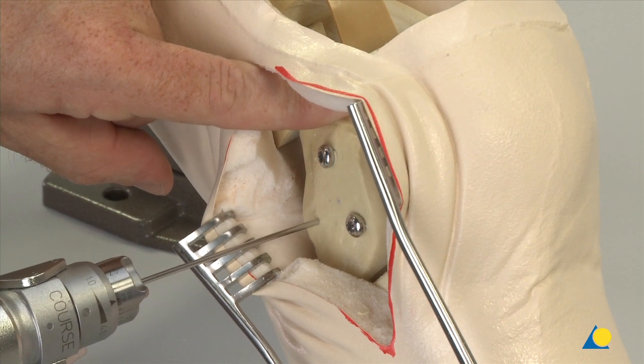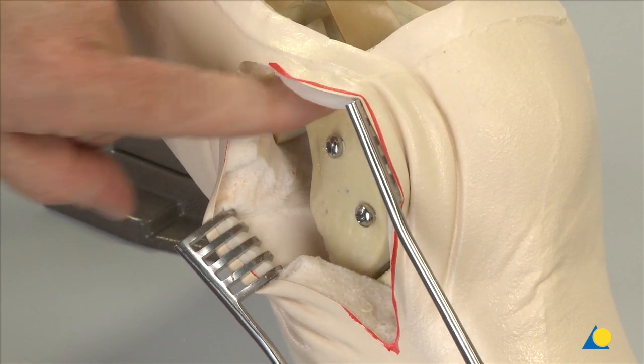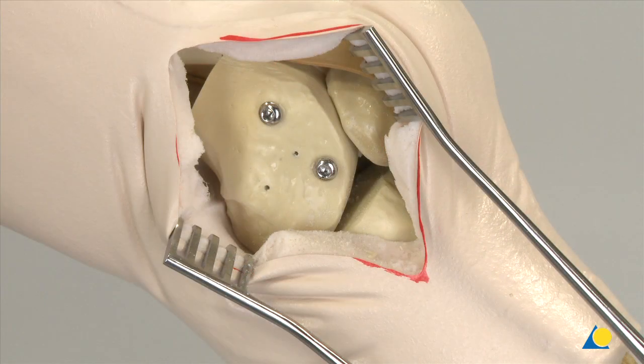The two K-wires are now removed. In certain fracture configurations, forceps and K-wires can be used to reduce the condylar block to the shaft. It is important to have a good reduction before the plate is applied. Use clinical examination and radiographic imaging to confirm the reduction.